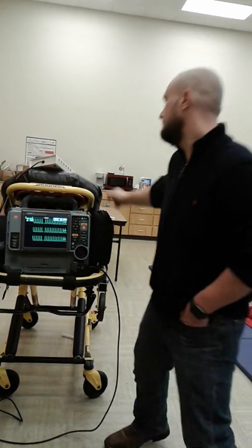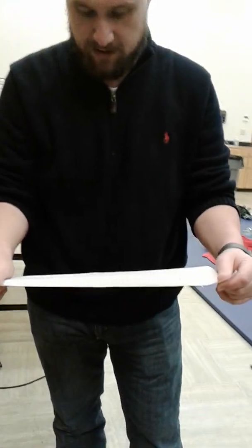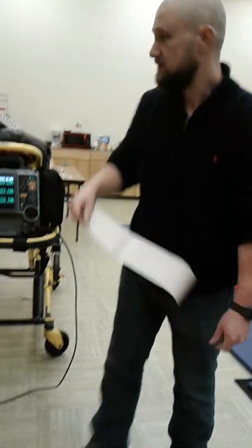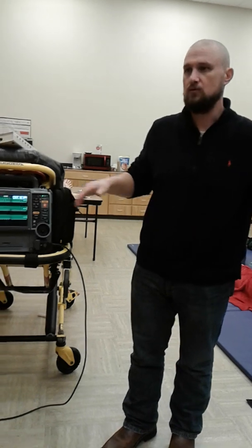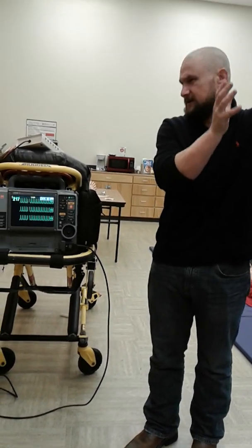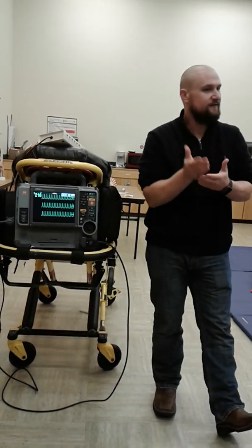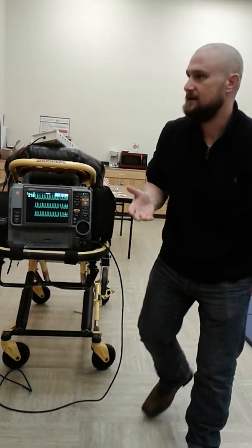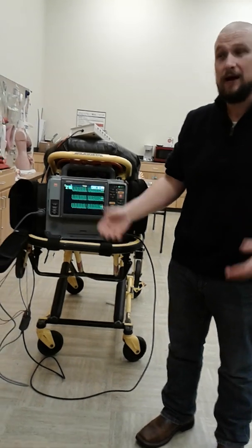Now if I look at that, if you're having a hard time, again, print it out, look at it. Is that QRS normal? Yes, it's normal. So everything from the AV down is normal. So I have to have a problem associated from the AV up. Does everybody understand that? Okay. So I know that anything in the AV up, I'm dealing with atrial or SA. Well, can I call that SA node firing? I don't have a P wave, so I can't call it.